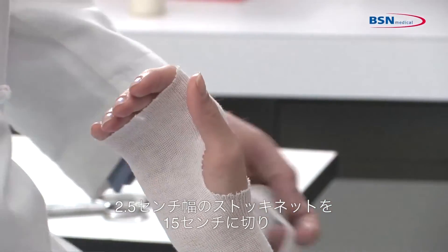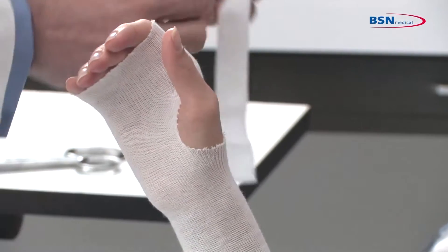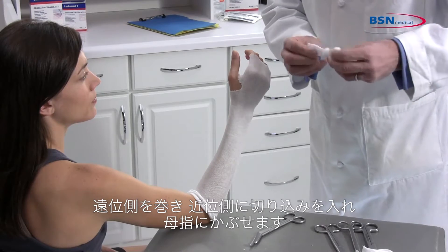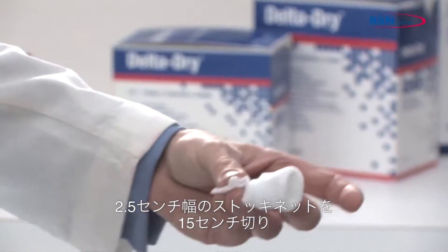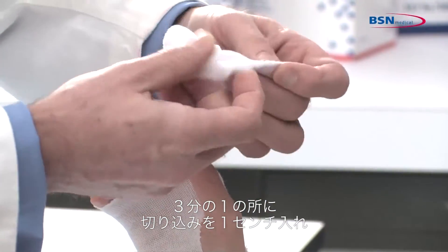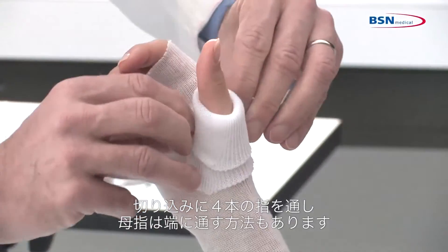Cut a 6-inch length of 1-inch stockinette to protect the thumb area. Roll up the distal end, making a small cut in the proximal end, and slide it over the thumb. Another option is to cut a 6-inch length of 1-inch stockinette, then make a 1½-inch cut at one third of the length. Slide the stockinette over the wrist and apply the cut section over the thumb for protection.